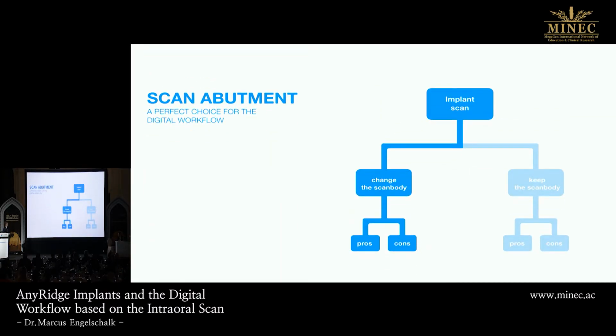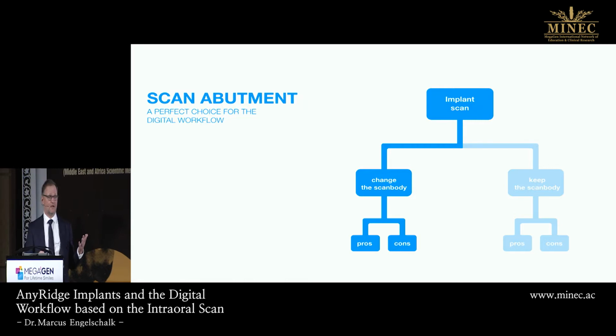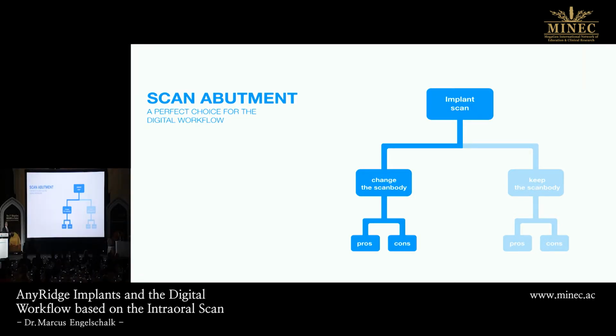You will transfer it to the CAD/CAM system. This means we have this way. There are some pros and cons. Well, we still have to screw 6 times, but we can be more precise. And we can do it at any time we want.